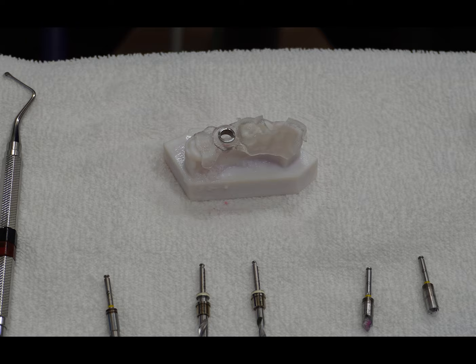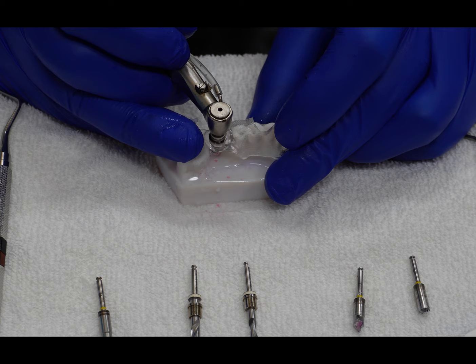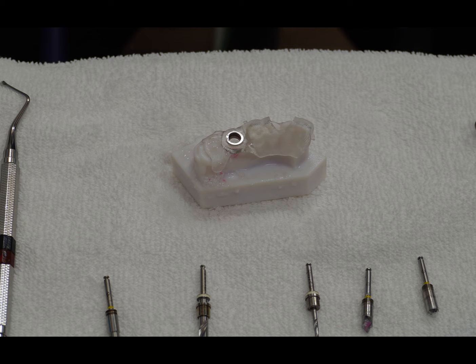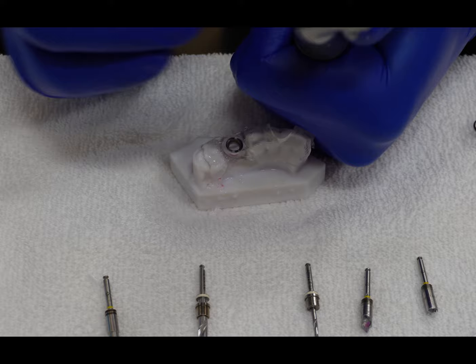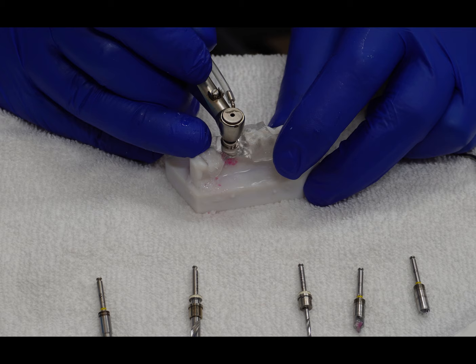Re-approximate the surgical guide and continue with the next osteotomy burr. You can see the sliding aspect on this which will be the stop component. Re-approximate, engage that surgical sleeve, and activate the rheostat — you can see that it stops vertically at that point. One point to make: when putting burrs in the patient's mouth you can slide the sleeve down using something like a Hollenback to push it all the way down to help seat it. It's a little easier on the model but it's good practice to seat the sleeve into the guide before you start drilling.